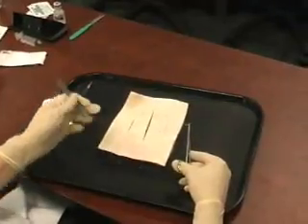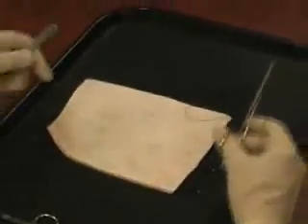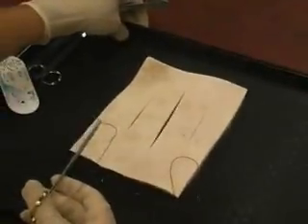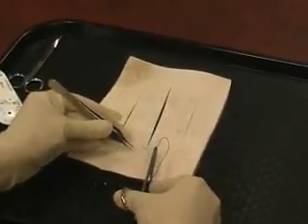A couple of things that we want to look at. Here's our laceration. It's nice and linear. In the OR setting, we oftentimes are going to suture in this direction. But in the ER setting, it's fine if you orient your body in line with the laceration. Some people like to start at one end and suture toward themselves, and that's fine.